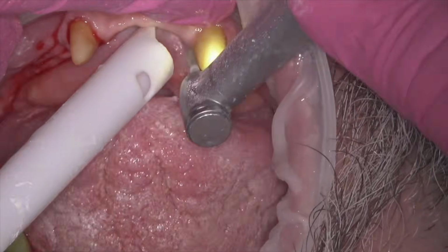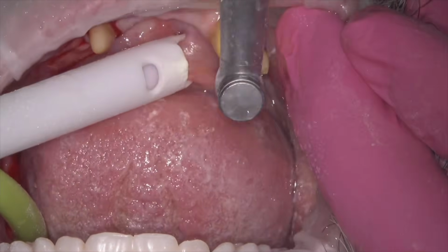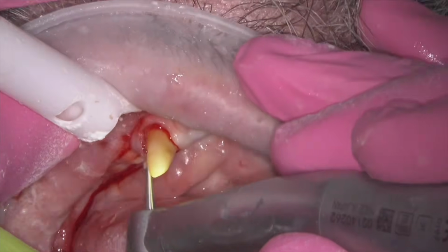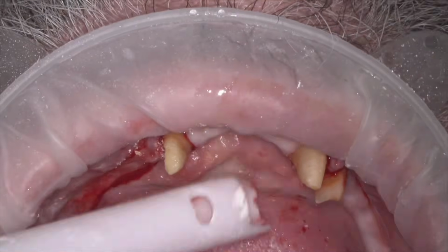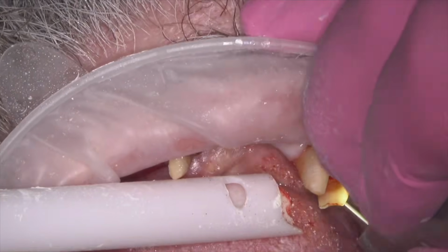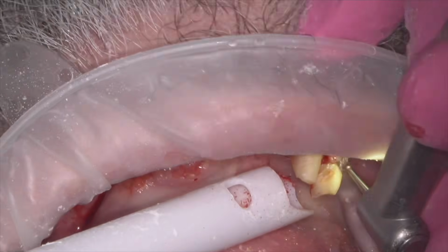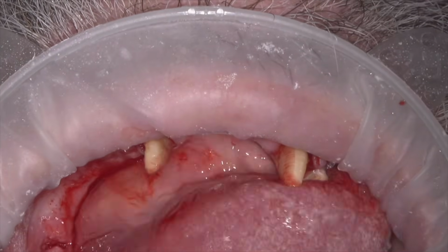I was considering path of draw for all 3 teeth to be coincident, because I am going to do a fixed prosthetic tying everything together. And if you could see, the edentulous ridge in the anterior has a massive amount of bone loss, and so I'm going to have to do some soft tissue around the bridge and make it cleansable, and that's a whole different design element that we'll talk about in a minute.